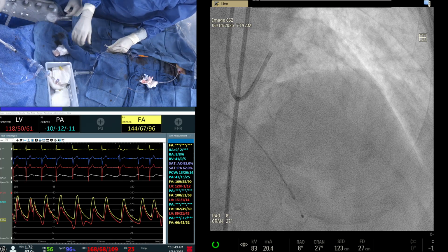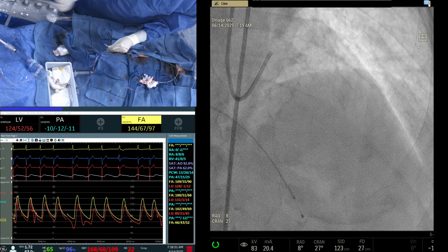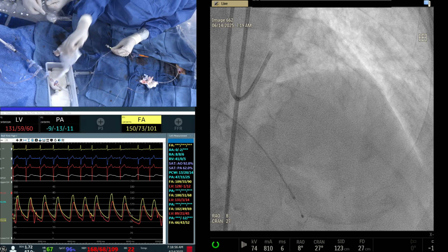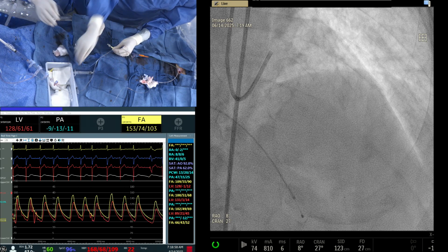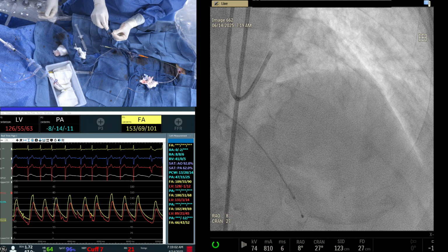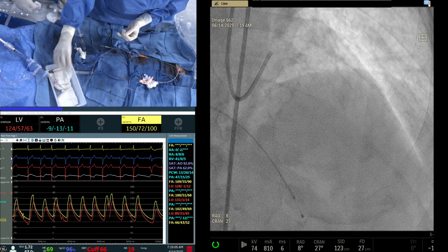Get us a new fielder wire. Okay. Is it a regular Rota wire or Rota drive? Dr. Sharma? Rota flop. Rotor flop, yeah. The other rotor, all are the rotor drive now.